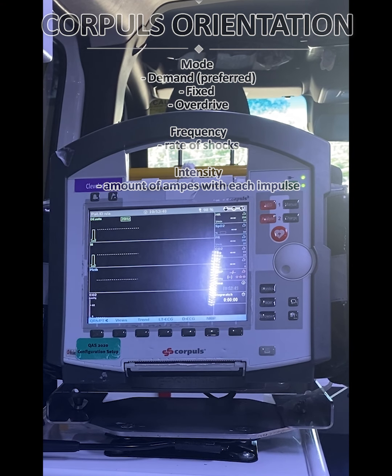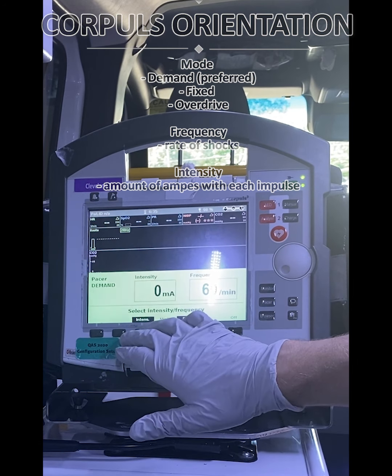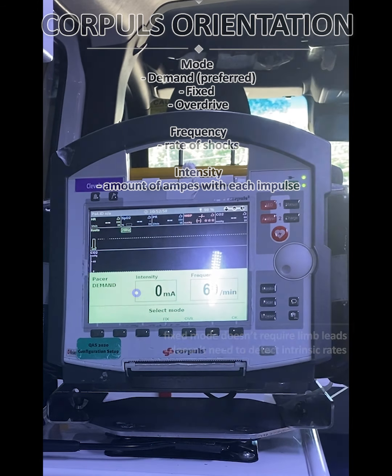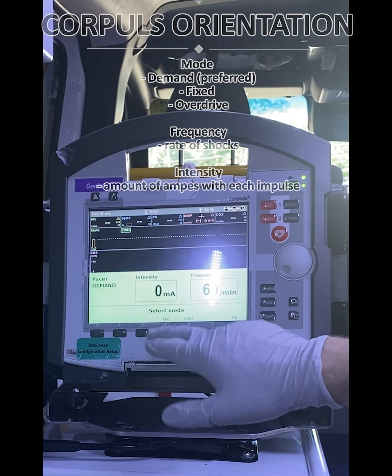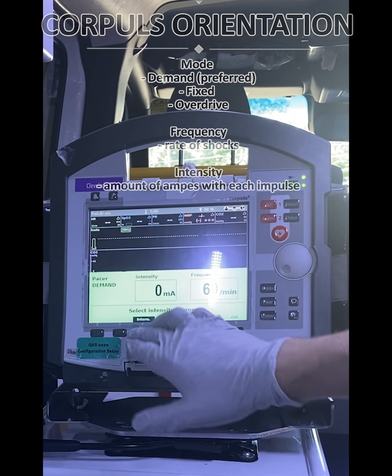So the first step with our Corpuls is to hit the pacer button to bring up our pacer menu. Here we have 3 different variables: intensity, mode and frequency. First we'll start with mode. We have 3 different modes. We have the overdrive, which is more for our tachyarrhythmias and overriding them. We also have set fixed pacing, and that will deliver the set amount of impulses no matter what the patient's doing, and then demand, which changes the amount of impulses delivered depending on how many impulses the patient is developing themselves, working with their intrinsic heart rate.